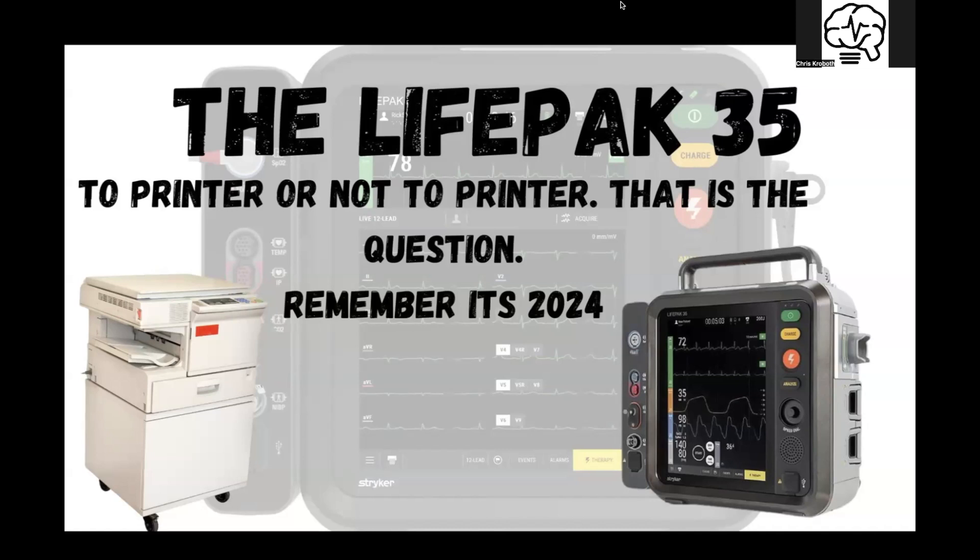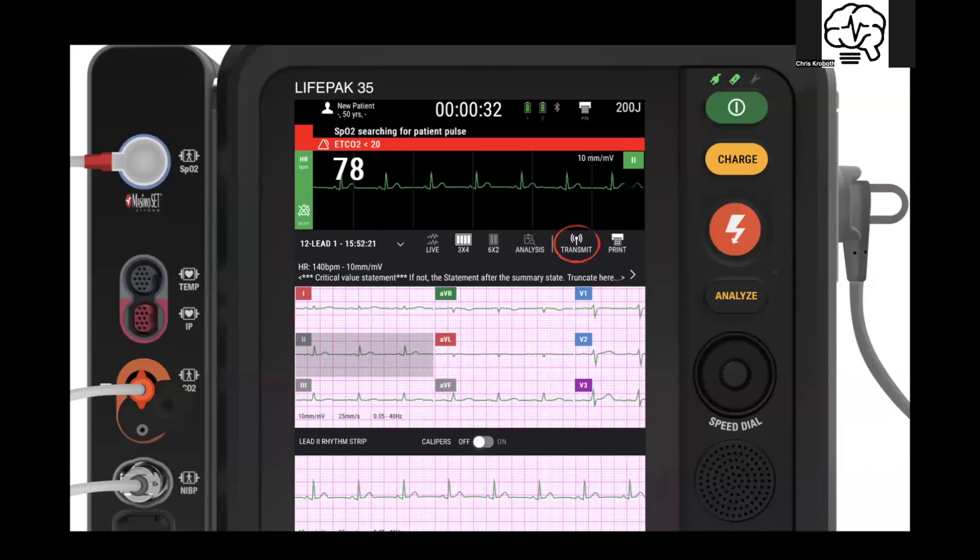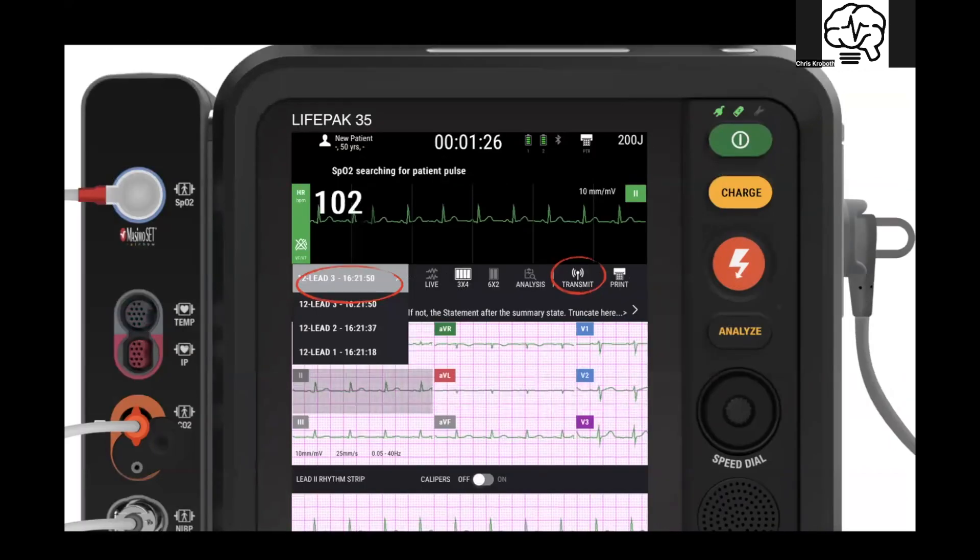In the next couple minutes we go over this, I want you all to remember it's 2024. The LifePack 35 has built into it the transmit feature — it's very fast and easy. You hit transmit, you can pre-populate the endpoints you want it to go to, whether it's a hospital or your unit's iPad, which we'll hit on here in a bit. You can also go to the dropdown and select which one you want to transmit, so it doesn't require a bunch of steps like other monitors out there.